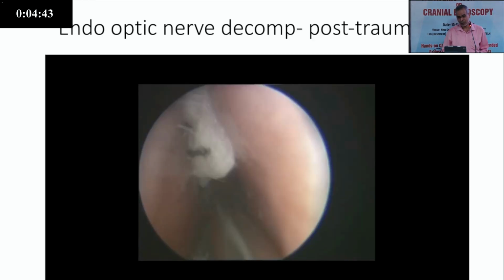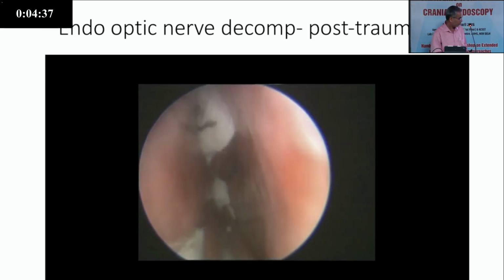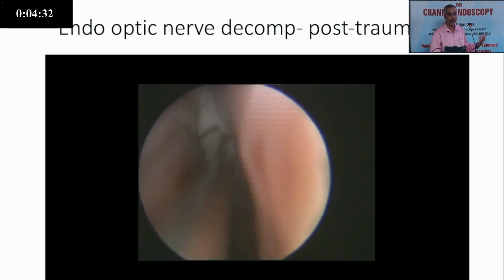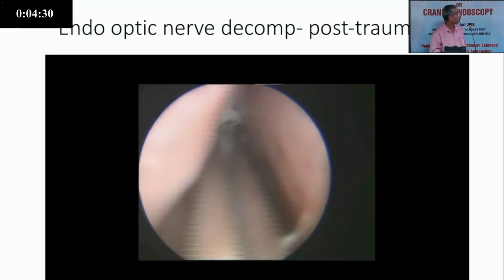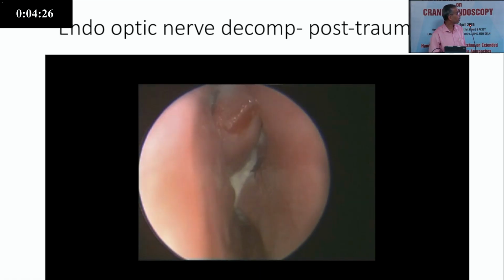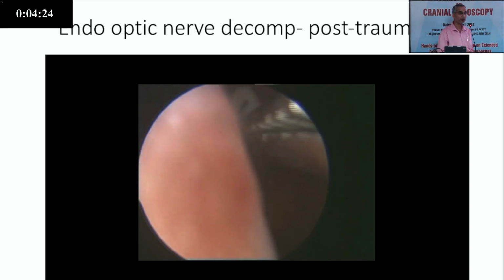This is a small video. So half of the video is to decongest and expose. You put a cotton wick under endoscopic control, because a small area of bleeding will obscure your surgical field.